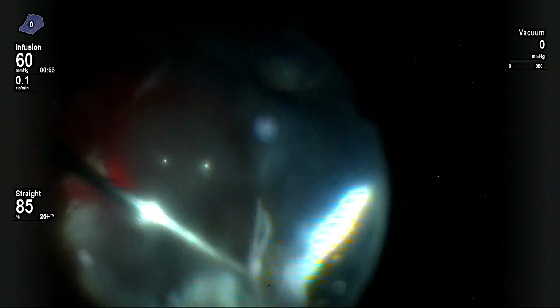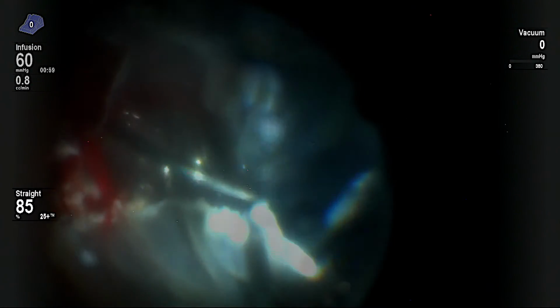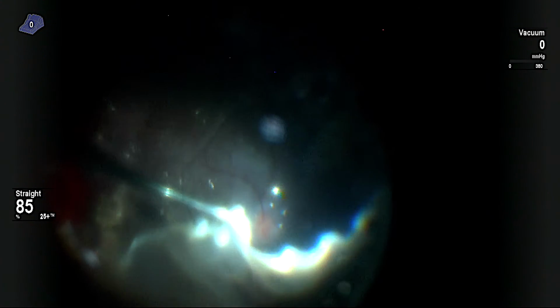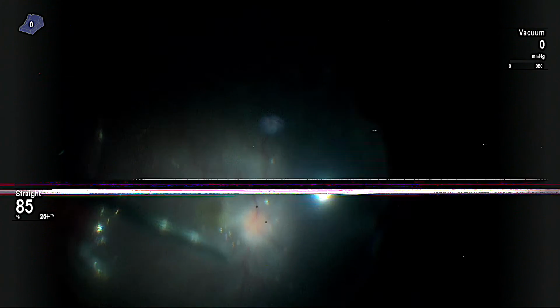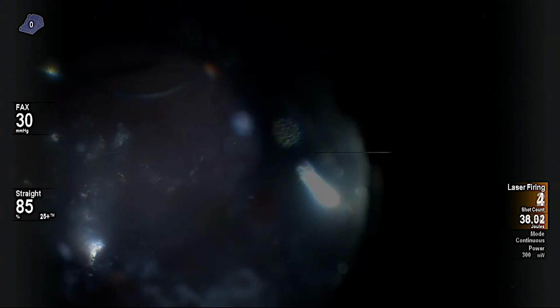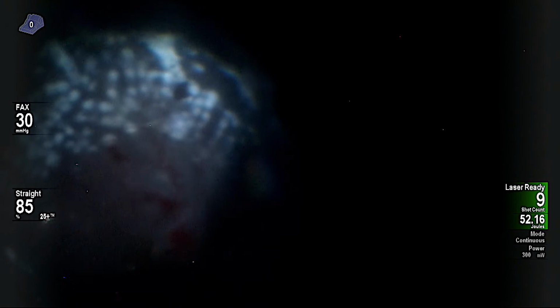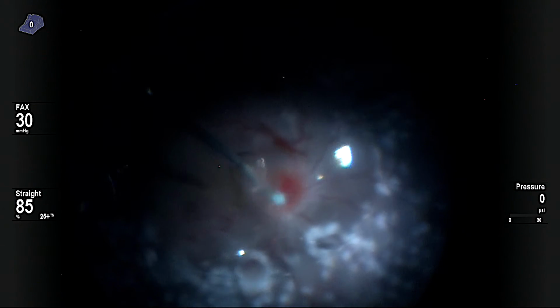Subretinal bands were removed. Retina settled with the help of PFCL, and PFCL oil exchange was done.